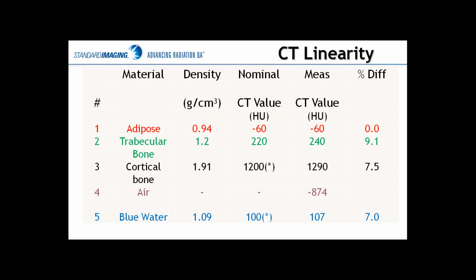Now, tolerance for this is a baseline level, and CT numbers are often quite variable, and sometimes we don't even have control over tuning the CT scanners. So as long as they are within about 10% of your nominal value as established on the scanner, I would accept that, and maybe go back and look if you'd like a second assessment, or change your ROI size as well.